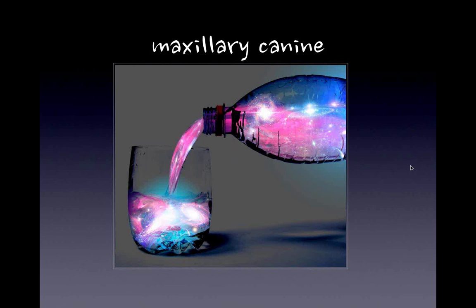Layering. Do you always retract with cord for these cervical lesions? Not always, but if I need to. If there's tissue in the way, I need to retract, or I can use electrosurge. I really like a very small, fine pin tip to do a little bit of electrosurge around the tissue if I can't get the bleeding to stop.